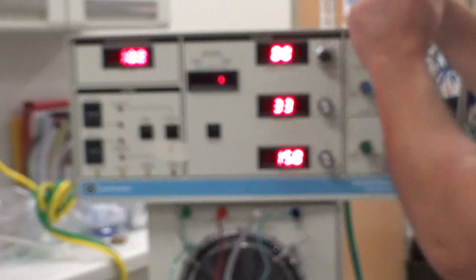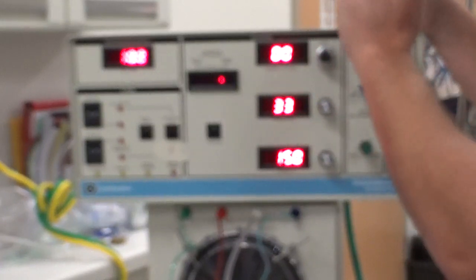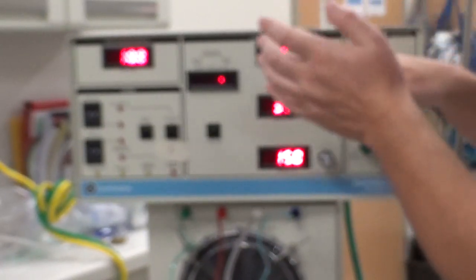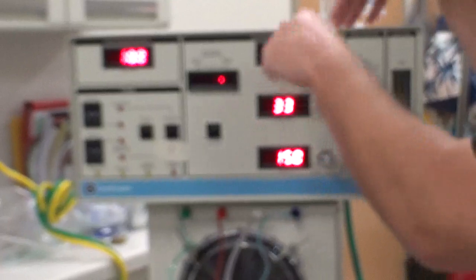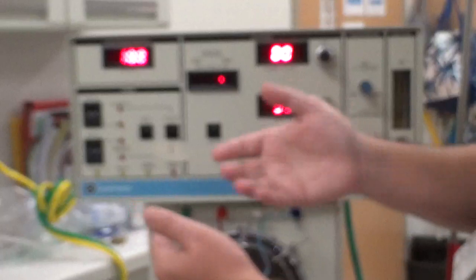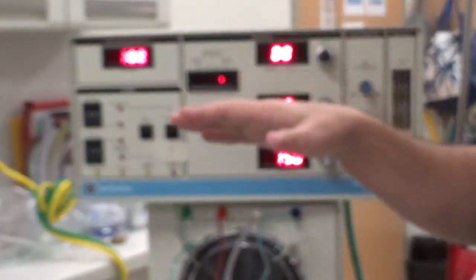Okay, so to get rid of CO2, we go up on the amp, down on the hertz. If we want to raise CO2, we go down on the amp, up on the hertz. For PaO2, mean airway pressure is generally up, FiO2 is up. If we want it to go down, we turn down our FiO2, and we may wean our MAP.